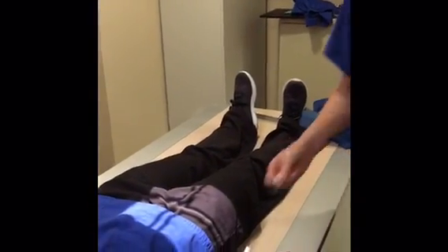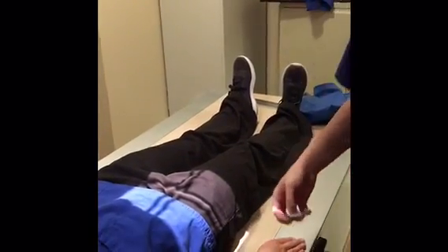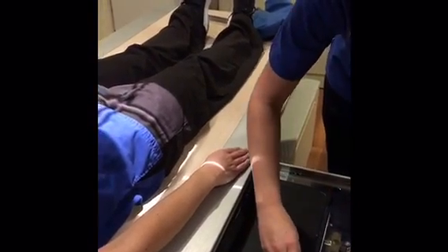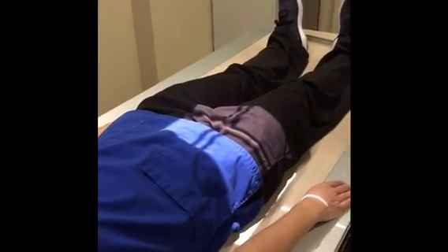Since I have a lot of light on the side of the patient, I can collimate in, making sure that I am still at a 10 by 12 collimation. I will place a right marker on the right side of the image receptor, making sure that I do not have the marker in the area of interest of the patient.